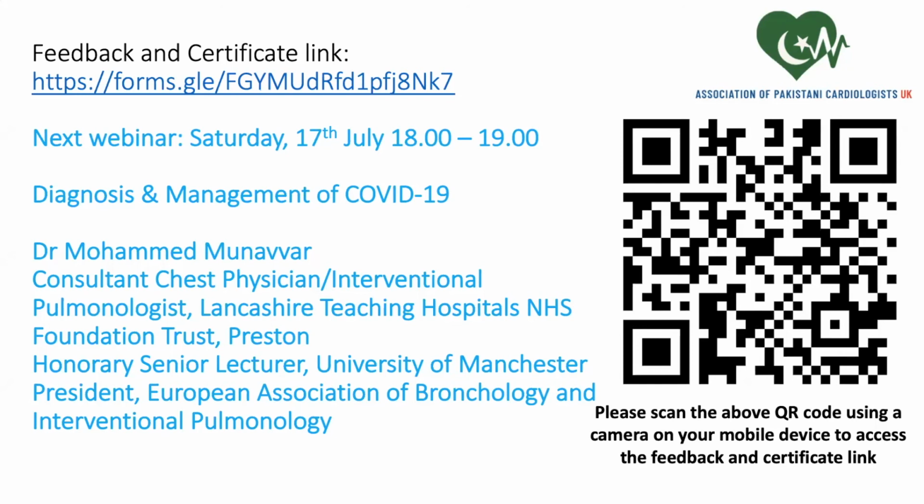And I'm actually going to throw back a question to everybody now. A lot of labs are limited in terms of what imaging modality they have. So going through the panel, if you had a choice, IVUS or OCT, and you could only have one, which one would it be? I'll go to the Javeds first.